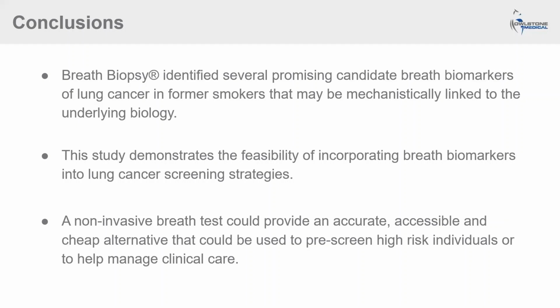This study also demonstrated the feasibility of incorporating breath biomarkers into lung cancer screening strategies, for example, to identify high-risk populations. Modeling data from this study suggests that just 3 markers provide very good accuracy in discriminating cancer from controls, and other data showed that subjects with indeterminate nodules had levels of breath biomarkers that were intermediate to the case and controls.